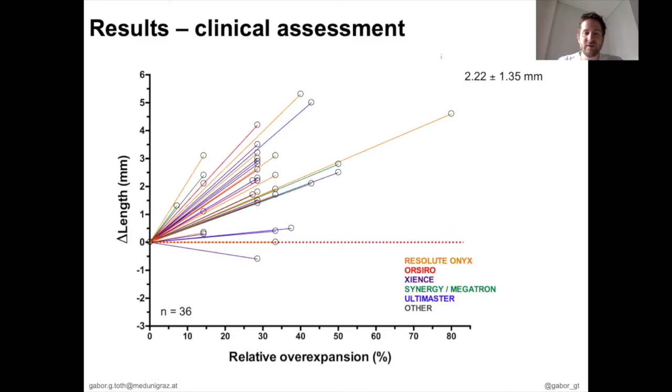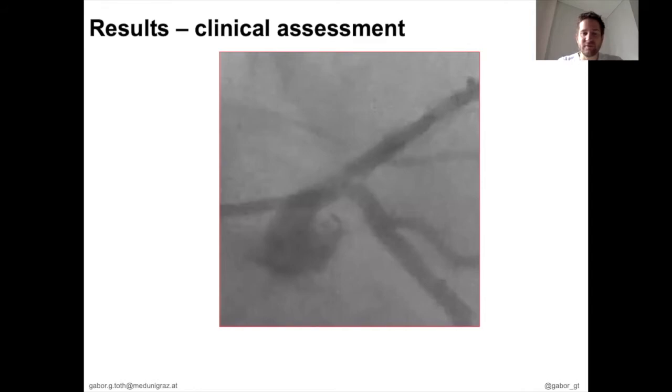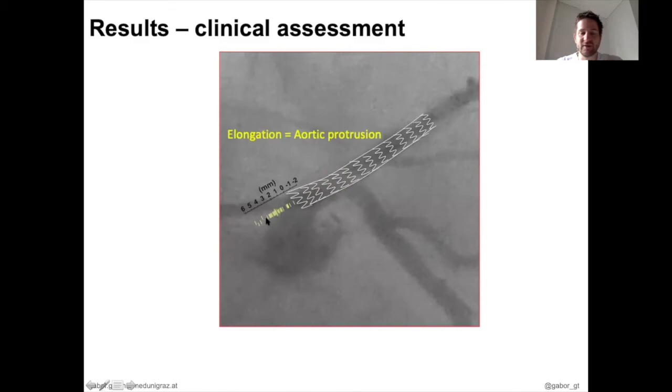So let's put these findings and try to interpret them within this one single distal left main bifurcation case, where the stent is placed and has to be corrected proximally with proximal optimization. If the stent is placed nicely to the ostium, then by proximal optimization we might end with such a proximal aortic protrusion demonstrated by the yellow lines, coming from the data of our cohort. And it's easy to realize that such protrusion might have relevant clinical and procedural consequences.